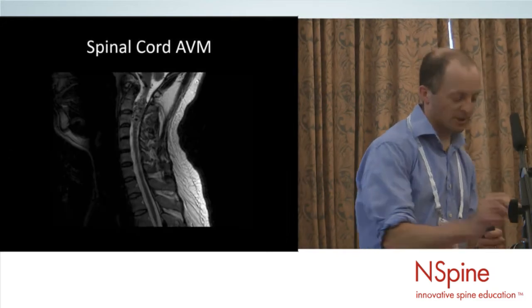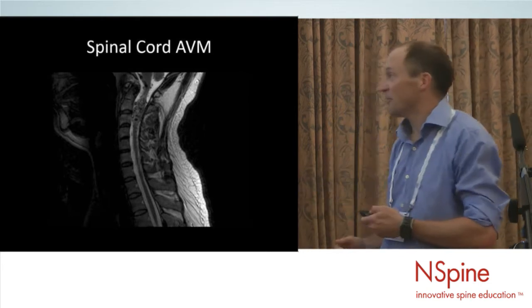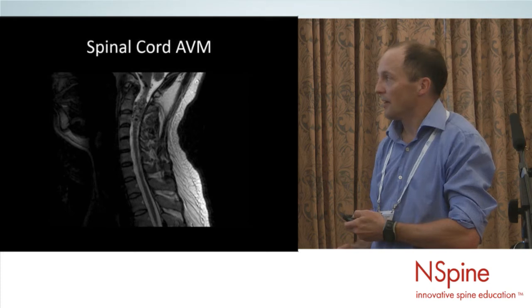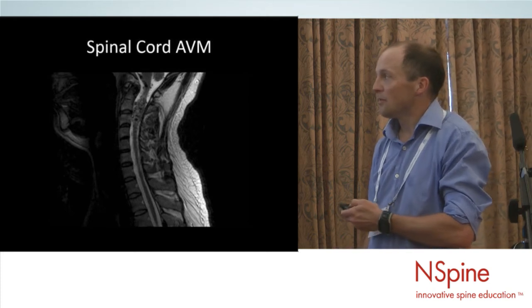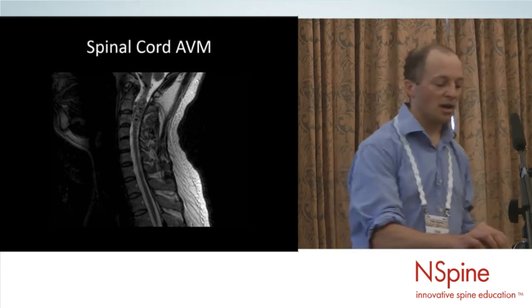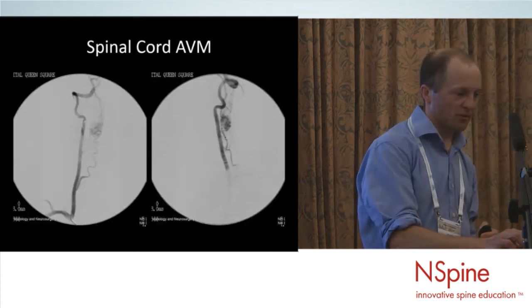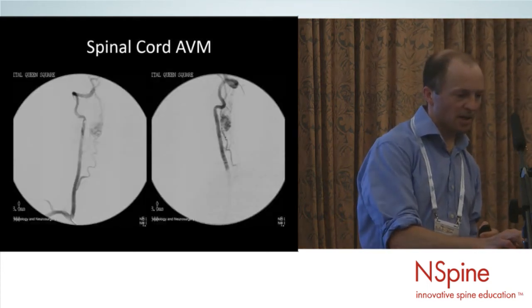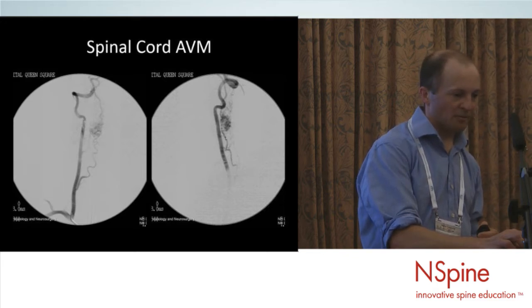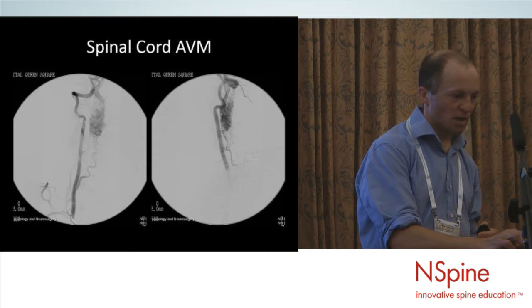And this is one which we did treat endovascularly, very similar to one of the talks, one that presented with high cervical cord lesions throughout the entire aspect of the cord, some signal change in the cord above and below, and some obvious varicosities or arterial aneurysms in the nidus itself. This is one we did in an adult, supplied by the anterospinal artery from above, and that's the flow.